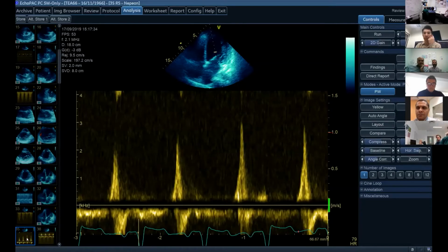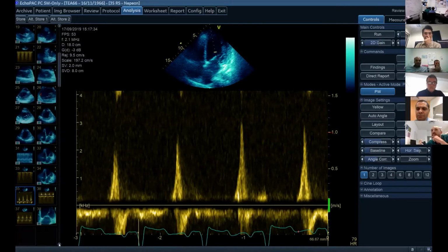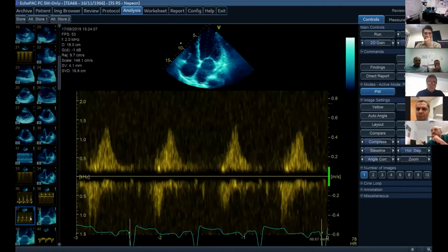So that was the E wave there, and 1.2. Almost 1.1. So that's 1.2, and I think that if I scroll down, yeah. So Carsten, would you mind describing the image there?